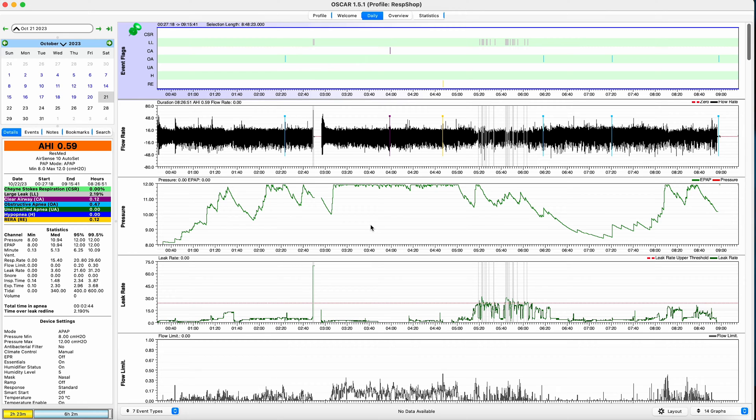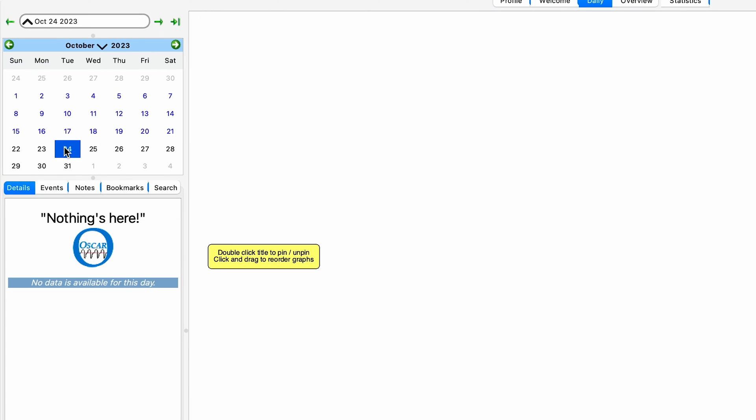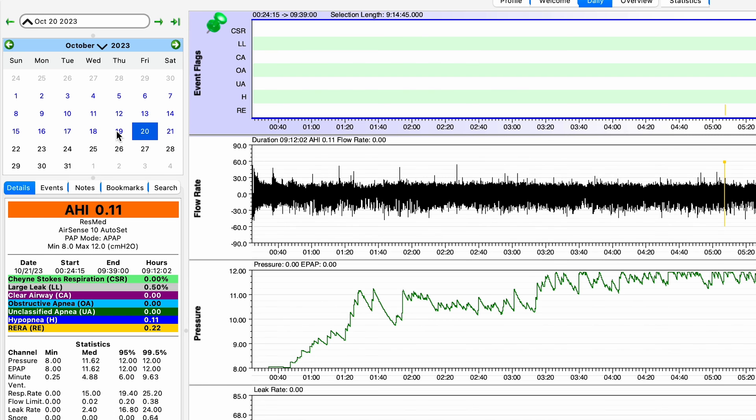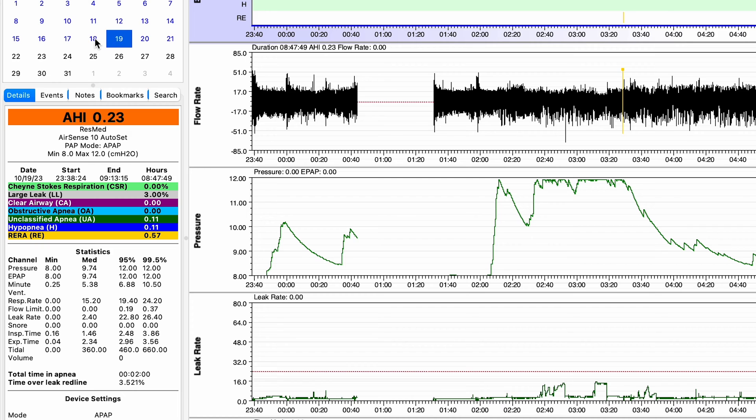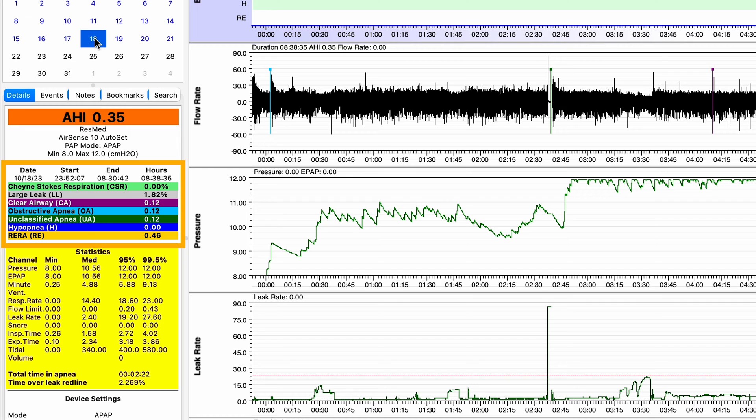But first, you just select the date, month, and year you want to view from the calendar on the left. If the date on the calendar is black, then that means that there was no data on the SD card for that day. But if it is blue, then there is data to view. Under the calendar, there will be some overall statistics from that day, and a chart that gives a breakdown of the nighttime events.